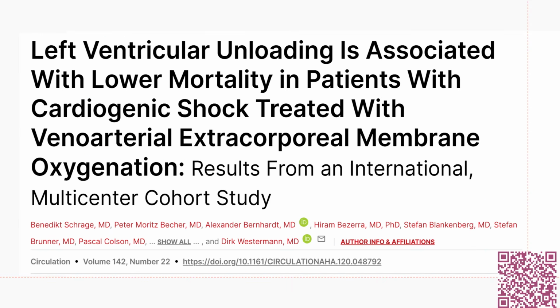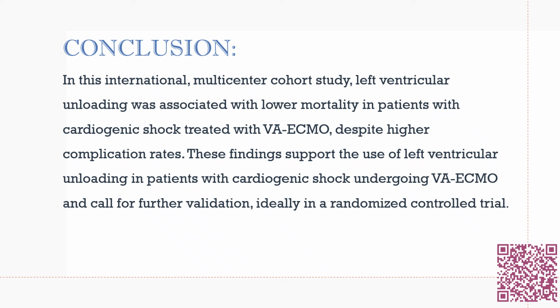This study is an international multi-center cohort study showing that left ventricle unloading is associated with lower mortality in patients with cardiogenic shock treated with ECMO. The study concluded that in this international study, left ventricle unloading was associated with lower mortality in patients with cardiogenic shock treated with VA ECMO, despite higher complication rates.